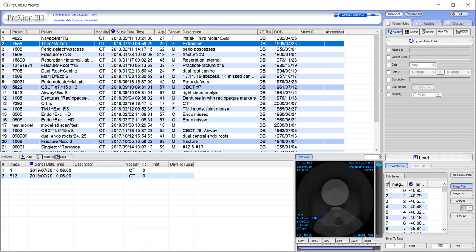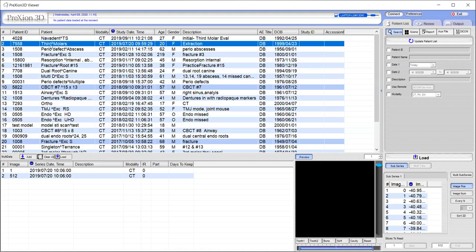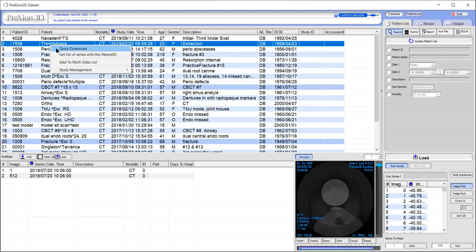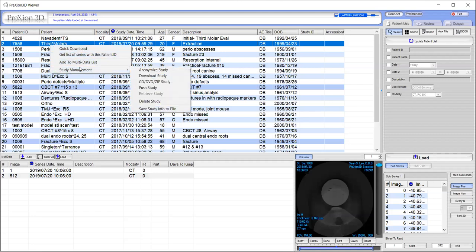So you'll want to first highlight your patient's name by clicking on that file once, and then you'll want to right-click to that file and select study management and then drop down to where it says CD slash DVD slash zip study.